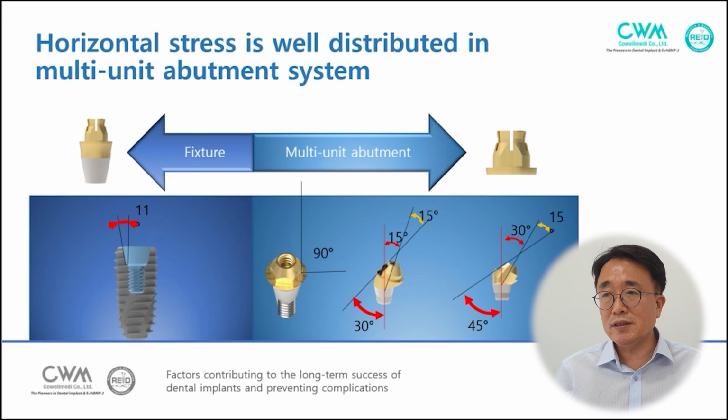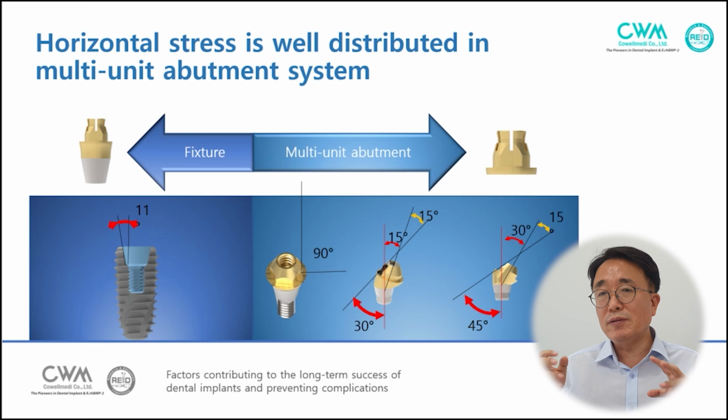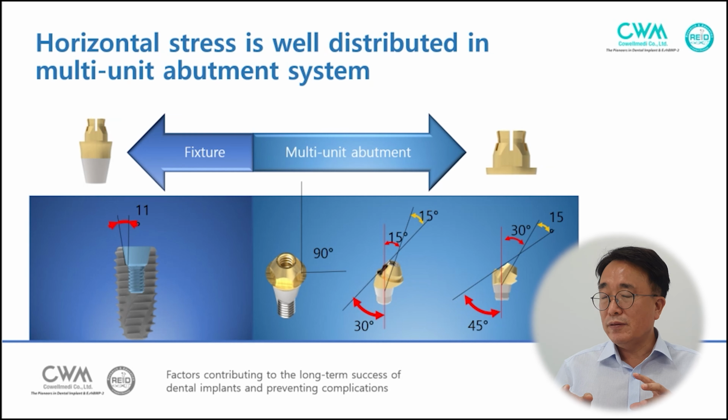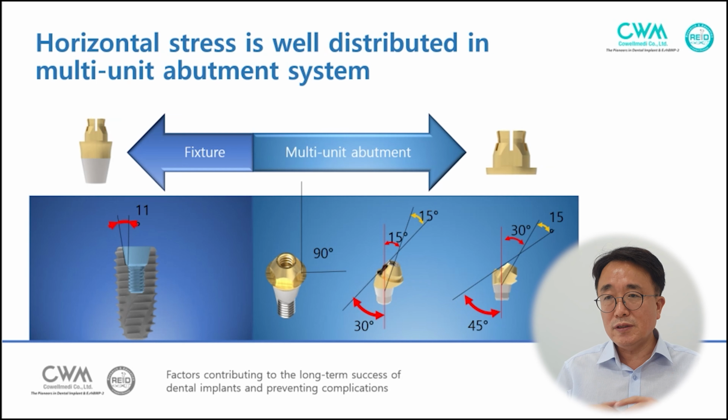So this connection has a correct and stable, firm connection between abutment and the fixture, not connection between restoration to fixture. So this component absorbs lateral force during occlusion. So we can protect implant fracture.